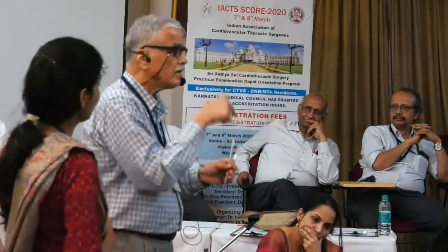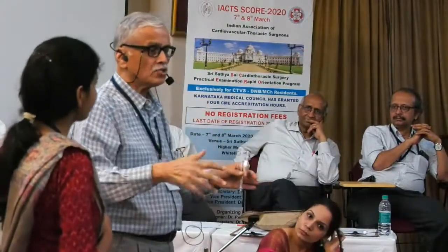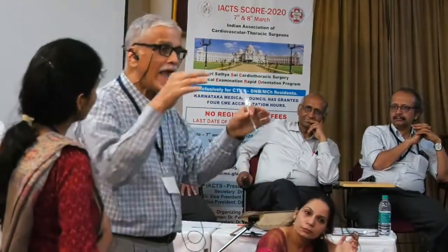So what chamber should be filled first? RA, then it goes to RV. So you just press the anterior part of the heart. Now blood goes across the pulmonary circuit to LA. When it comes to LA, the anesthetist starts ventilating. So passive filling followed by active filling.